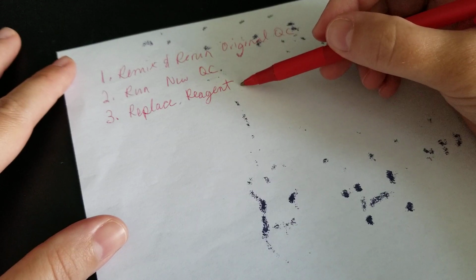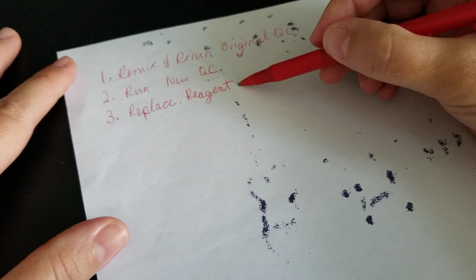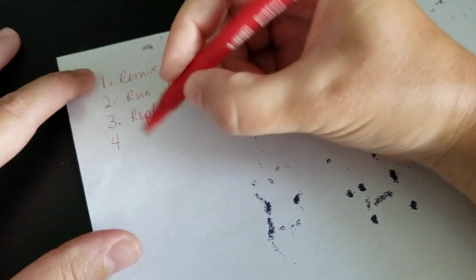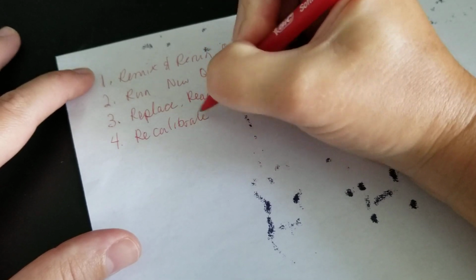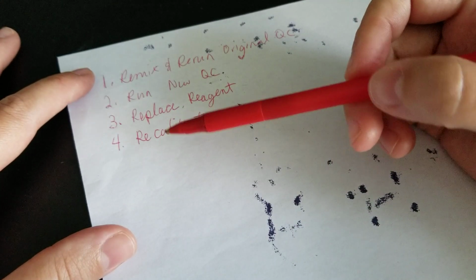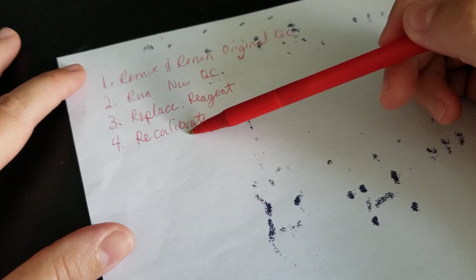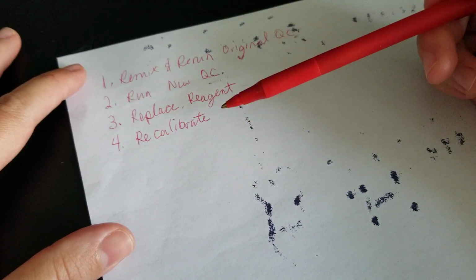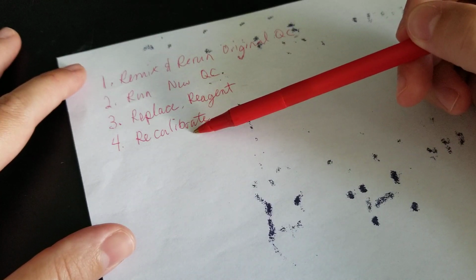If the QC was not in and the reagent was the same lot number, or maybe it wasn't the same lot number, you would replace, recalibrate. So the reason that we say recalibrate is because at some point, if this was not a new platform you're putting on your analyzer, then you have calibrated it before. So this would be recalibration because you've already calibrated it before with that same lot number. If it was a new lot number, it would just be calibrate, okay?